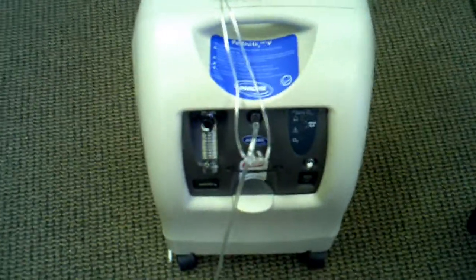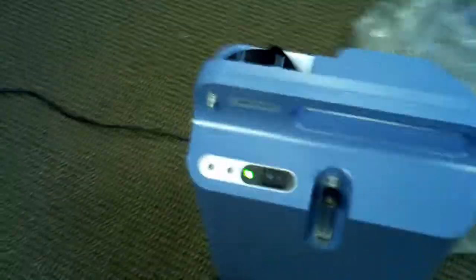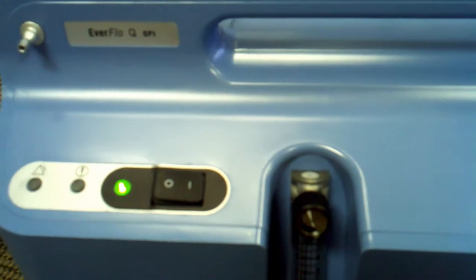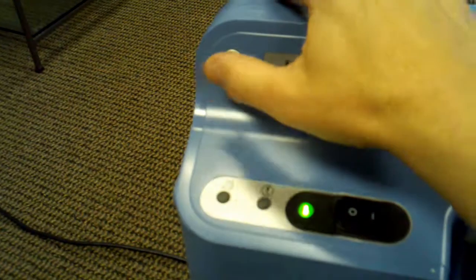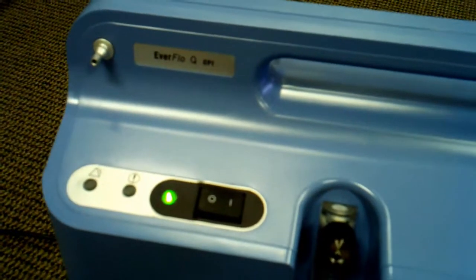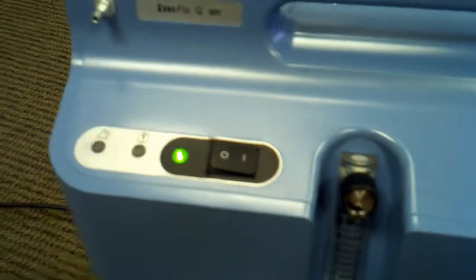Now, looking over here at the Perfecto — this replaced the Platinum model, which was about 54 pounds. It was quite a bit bigger and quite a bit noisier. This one right here is the Everflow Q with OPI. That stands for Oxygen Purification Indicator. It has a built-in analyzer which will sense if this concentrator is not creating over 90% pure oxygen coming out into your nose through a cannula or mask, then it will go off. It's constantly analyzing how pure the oxygen is. Since you can't smell it, see it, or taste the oxygen to know how pure it is, this is a good indication of whether it's working properly.